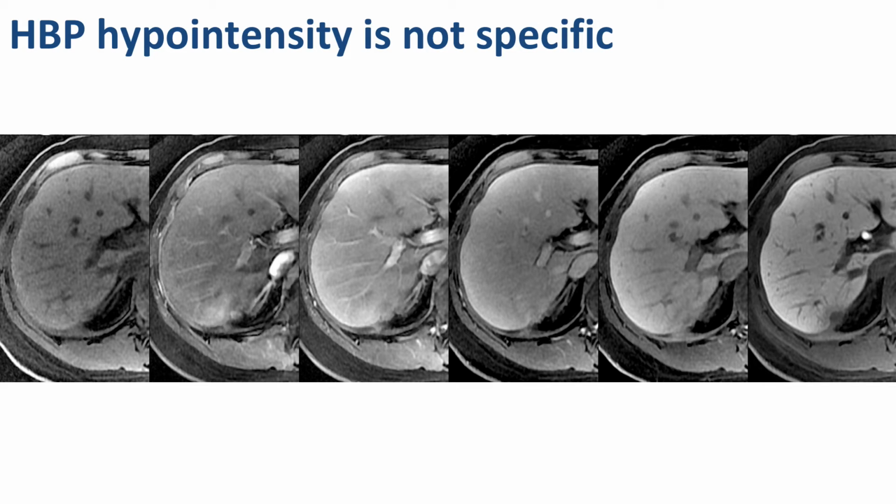Would anyone have gotten this right, by the way? Maybe none of us were any good. Okay, none of us are good. We all suck. Okay, at any rate, the teaching point of this is not that next time you look at this, you should say piece of spinach.